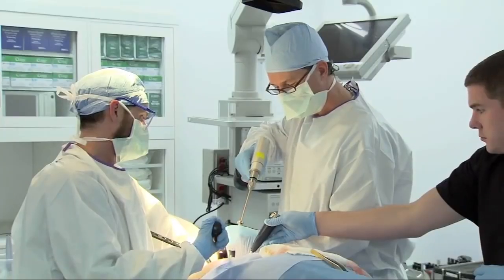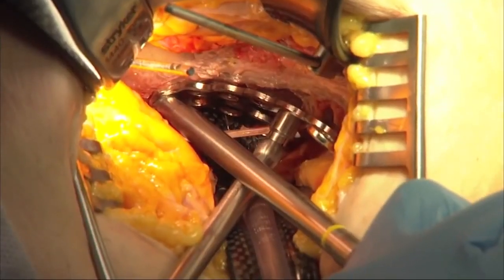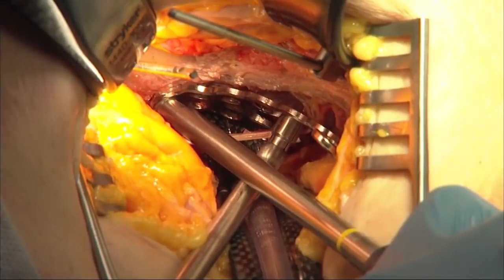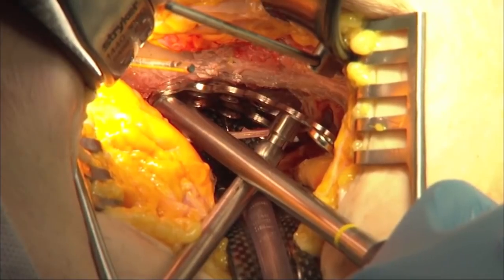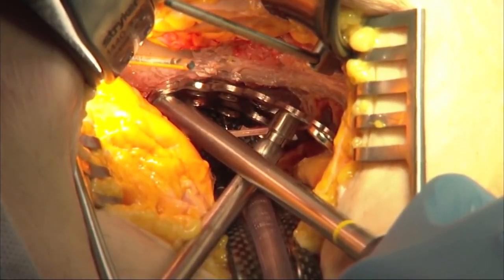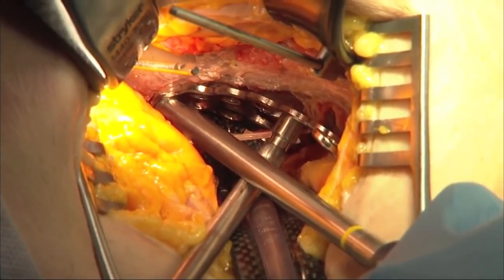This device works just like the spike screw inserter in that there's markings on the drill bit, and you use the cannula and the handle to drill, guide, and also measure for the length of the screw. Once we get it drilled and we have our length, we're going to take a 26 millimeter screw here.